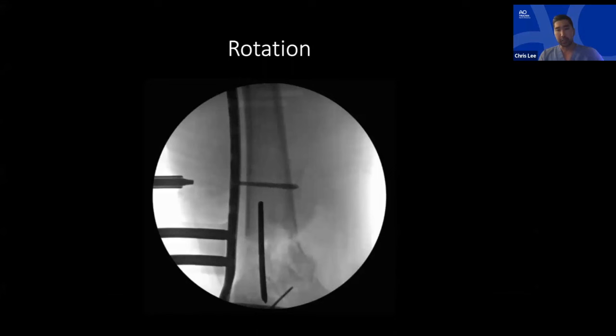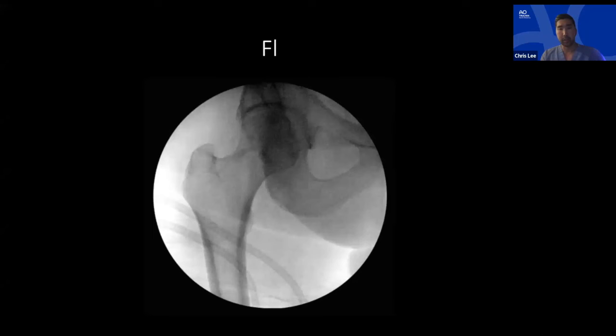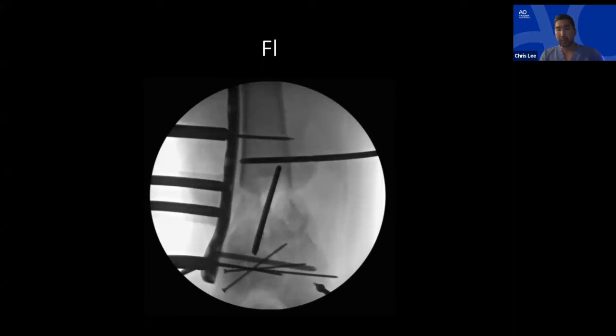Rotational alignment is commonly overlooked. When applying the plate and seeing the shaft is far from the plate, reassess rotation. The most common error is external rotation of the articular block — when externally rotated the pre-contoured plate no longer fits. Looking at the other view you see much more lesser trochanter. Internally rotating the articular block brings the shaft bone much closer to the plate. Ensure you're not extending the articular block and that rotation is correct — then the plate fits and you avoid golf-clubbing.